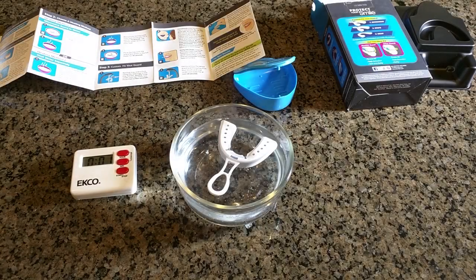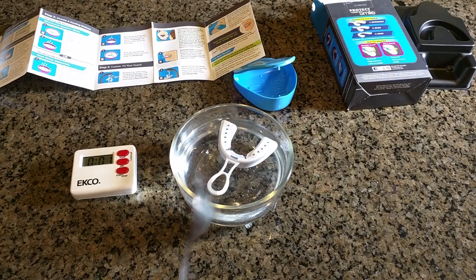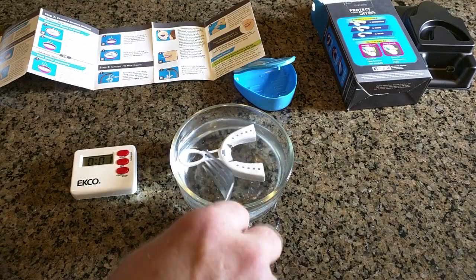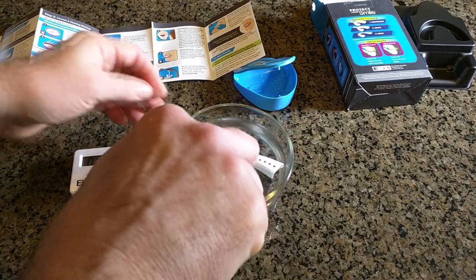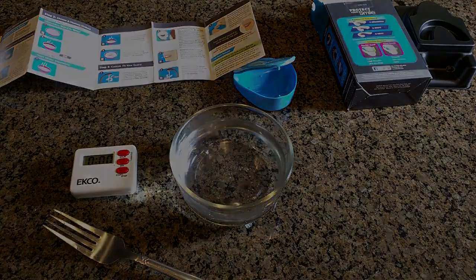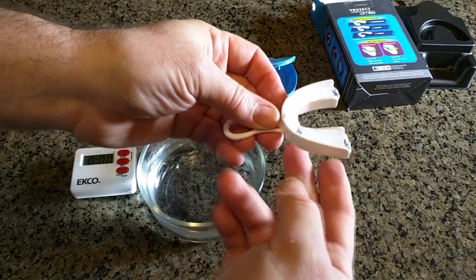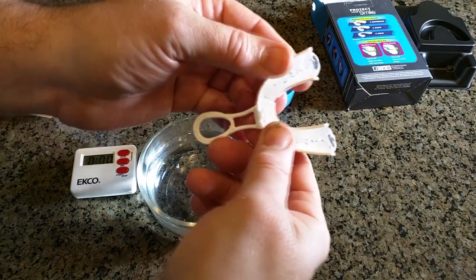Take it out of the hot water using a fork and run it under cold water for a couple of seconds. Then place it on your upper teeth. I'm going to use my finger to push down the front as I slowly bite down on the back. The timer goes off. I rinsed it quickly in the sink with cold water, then placed it and did the compression on my teeth. I put it on my upper teeth, pushed down initially using my fingers, and felt it mold in. Then I was able to bite down. Initially I had to push down on the front — and there is a pattern right there.